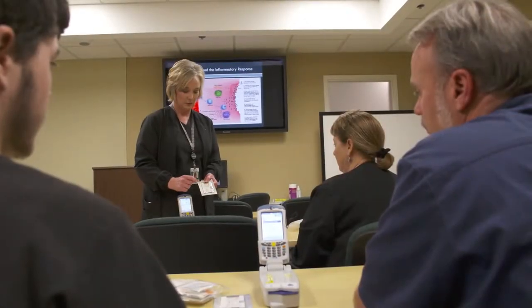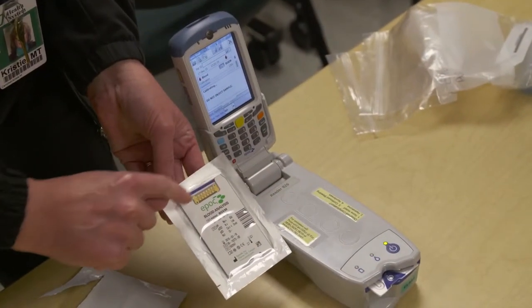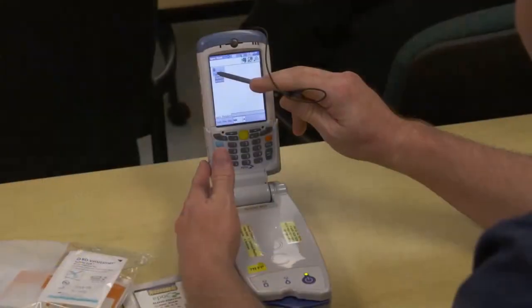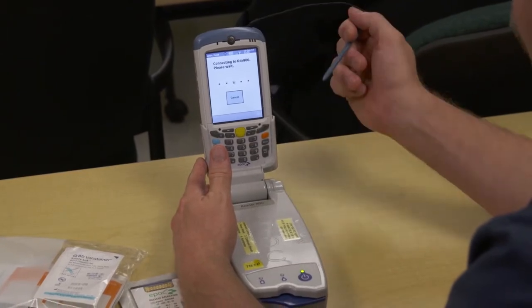If you have any patient population where blood management is crucial, then a point of care device is very useful in those types of settings. It can provide a quick result on a very small amount of blood, and that is really important in some of our patient population.